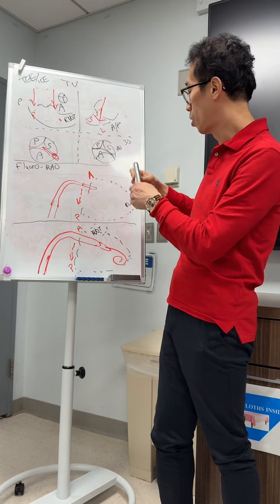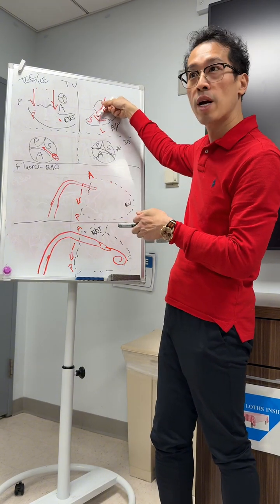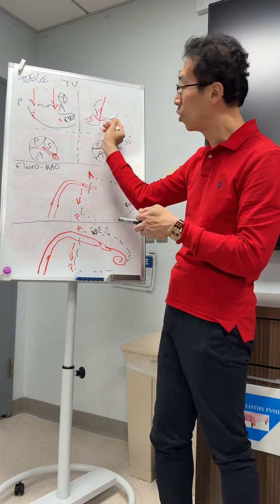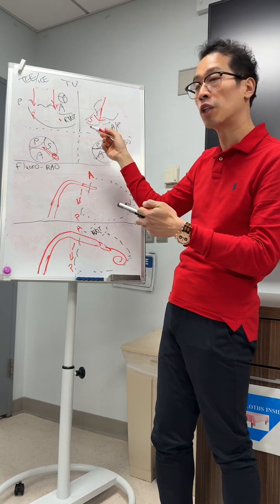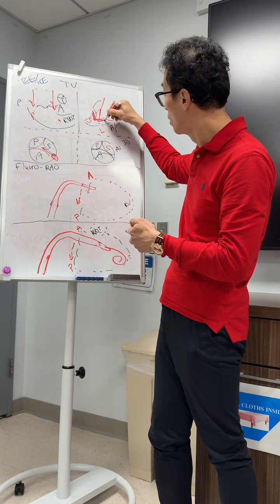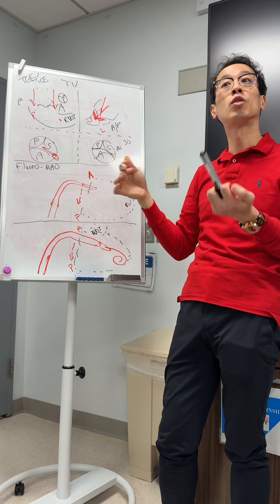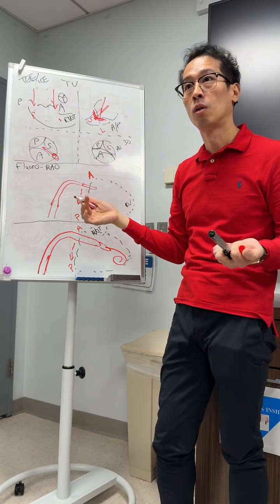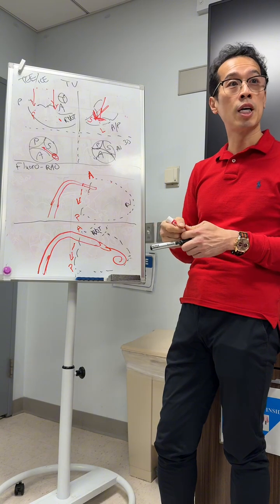right? You want to be able to do it in a more coaxial manner, so you can cup the two leaflets. Especially tricuspid, it's flimsier, there's respiratory variation, we talked about that before. So you want to ideally be like this, right, when possible. Sometimes it's harder to do that. You might be maxing out on your SL now, okay? So that's important, right? You guys agree?